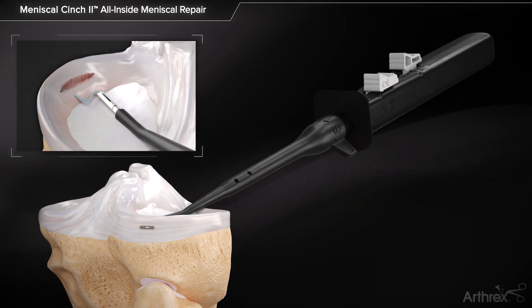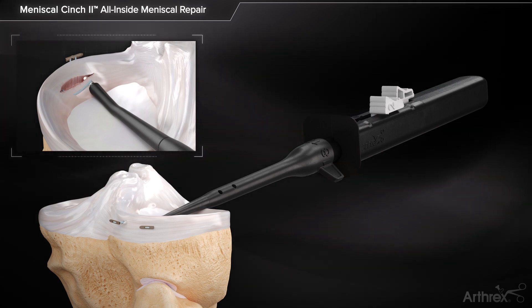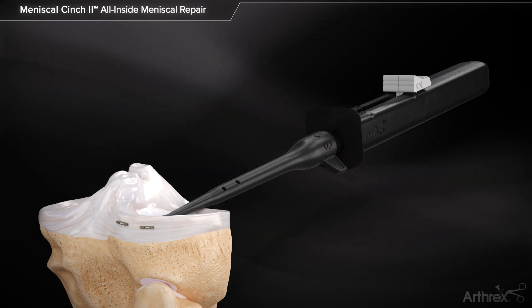Advance button number 2 forward to the indicator. Advance the needle through the meniscus to the desired depth and advance the button completely. Fully retract the button so that it is in line with button number 1.